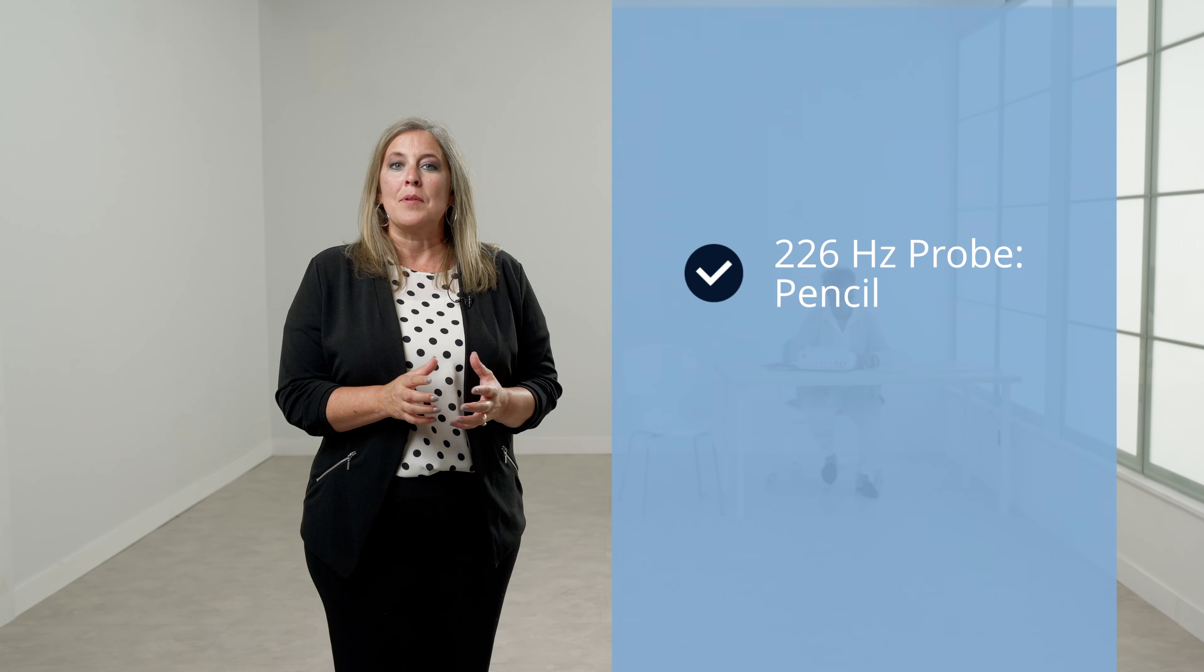Instead of seating the probe tip deep in the ear canal to obtain a seal, the probe tip should be held at the entrance of the ear canal to achieve the seal.